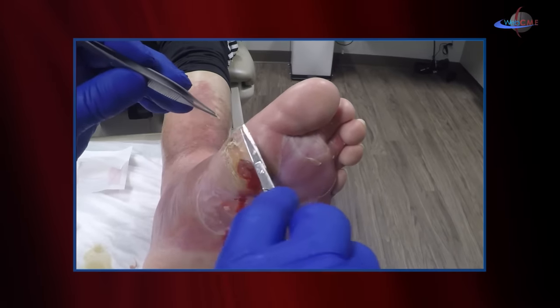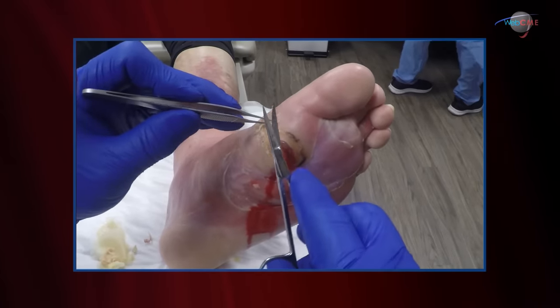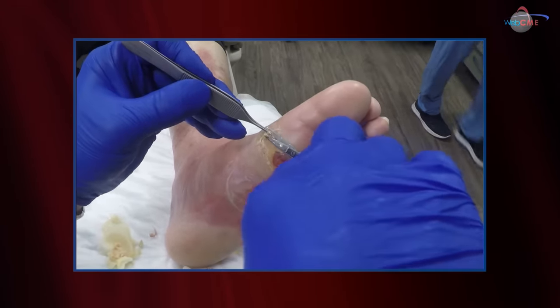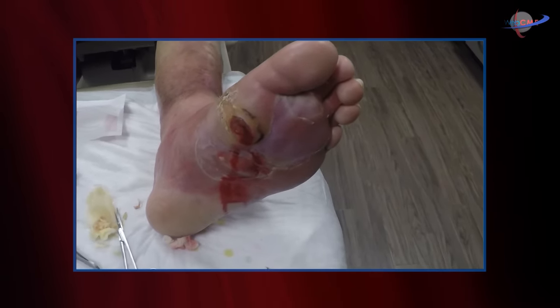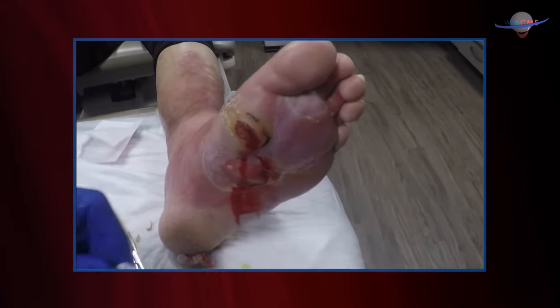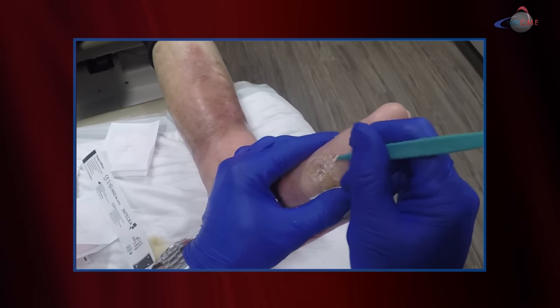Once again, the bane of our existence as wound care providers taking care of diabetic foot ulcers — the development of callus. Callus builds up and leads to ulceration. I'm not expecting to find anything under this area, but you never know.